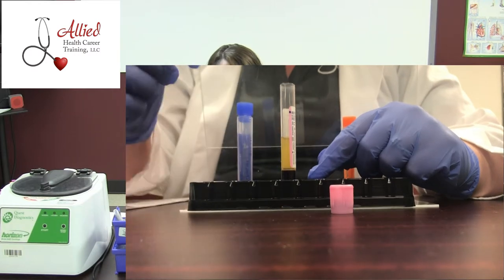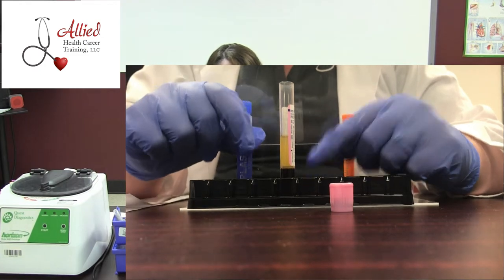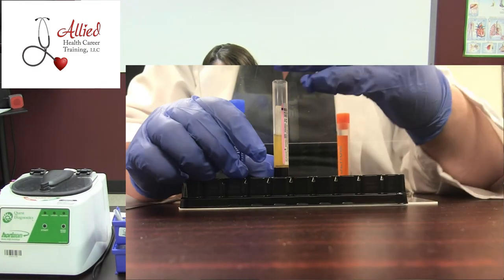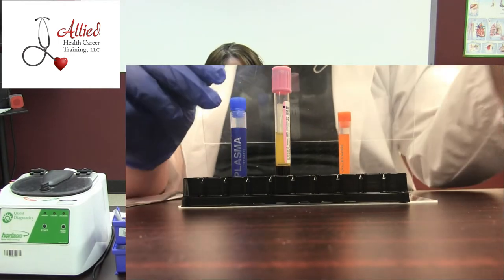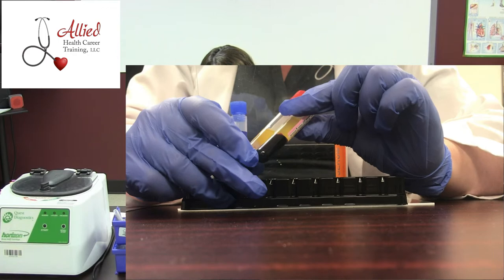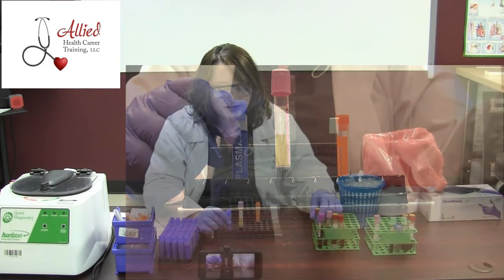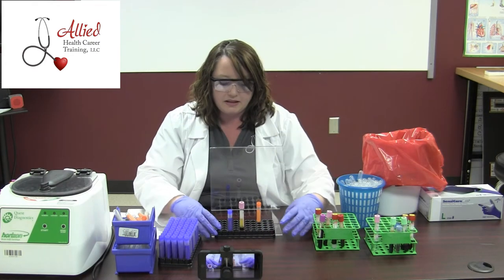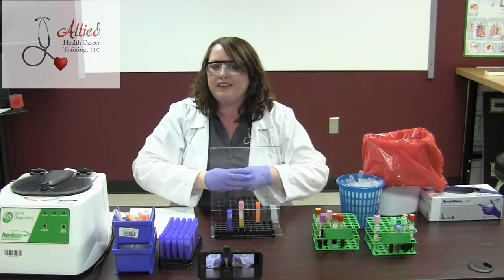Also, you definitely want to make sure you mark it plasma or serum, because if you notice, there's not a lot of difference between the two in looks — plasma and serum look very, very similar — and your lab technicians are going to need to know the difference. This is Brandi with Allied Health Career Training. Thank you guys so much.